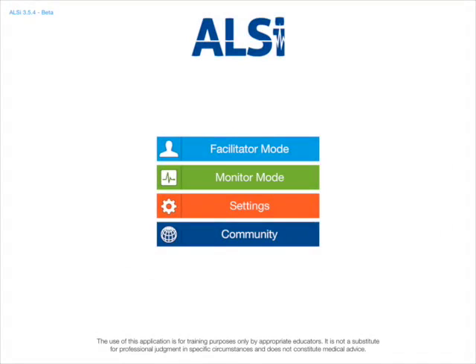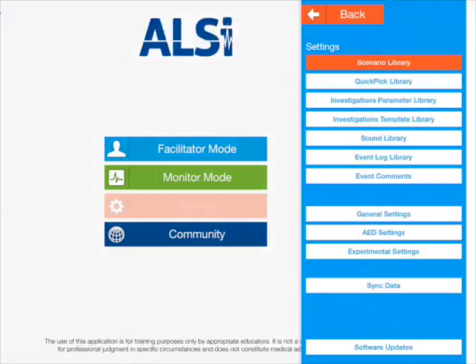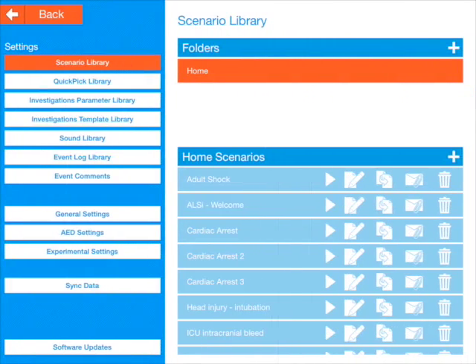Let's start off with the home screen on ALSI and go to settings. You can see in settings there are lots of options here, but if you look at the home scenarios, these are the scenarios that come with ALSI. You've got Adult Shock at the top — we're going to edit that by pressing on the edit icon.